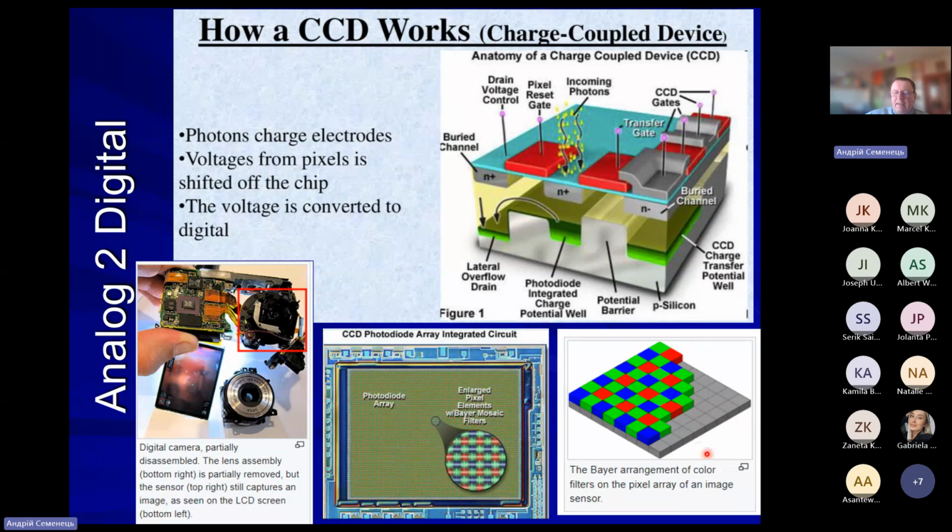And if we want to create an image, we have to make a matrix of many of these devices. An important point here is that a conventional such device is adjusted to only one relatively narrow frequency band, so it could produce only a monochromatic image.